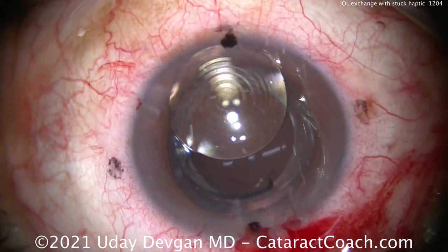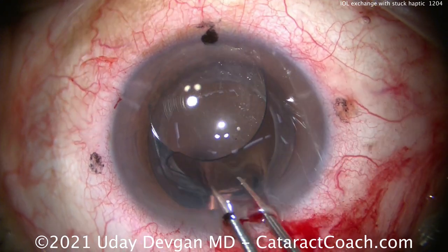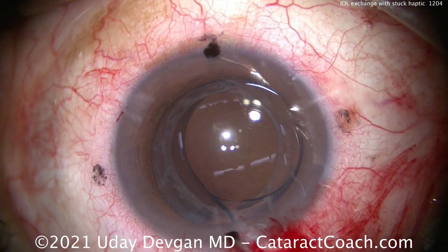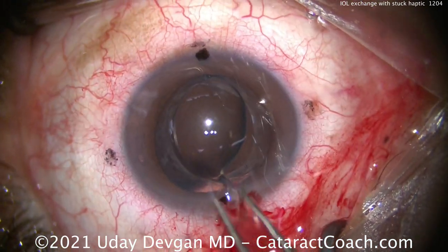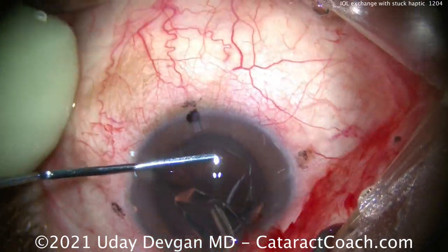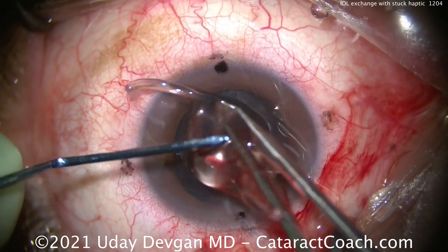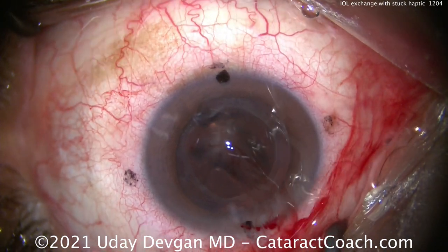Now both haptics are freed up from their capsule attachments. We can bring this lens up into the anterior chamber and we're going to explant it. We're going to do the twist-and-out technique. There's the forceps outside the eye grabbing the optic, using the spatula to help fold that over, roll it, and bring it out of the eye. There it is — there is your entire lens. That looks great. Get that off the field.